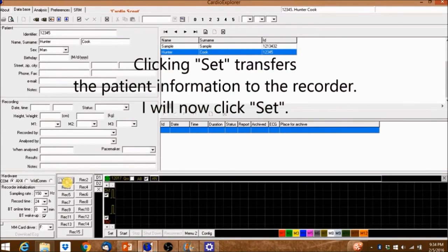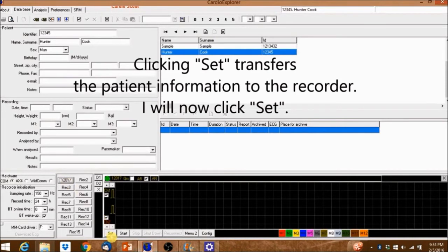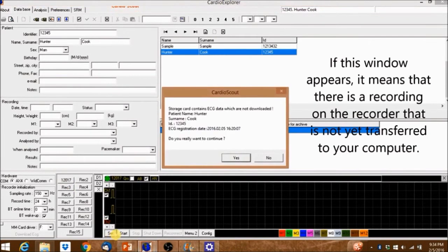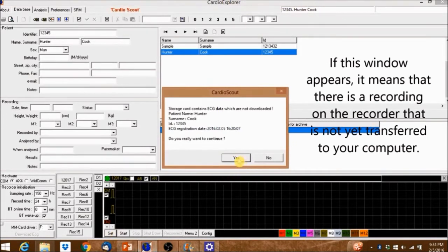Clicking Set transfers the patient information to the recorder. I'll now click Set. If this window appears, it means that there is a recording on the recorder that is not yet transferred to your computer.